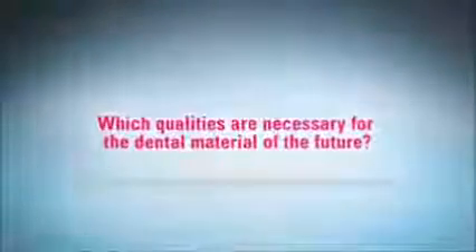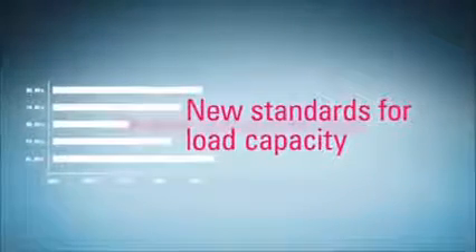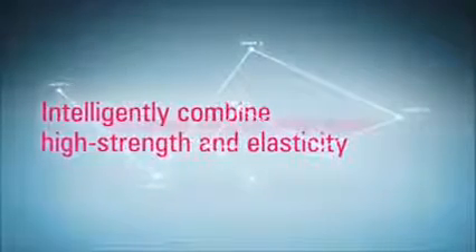Which qualities are necessary for the dental material of the future? It must set new standards for load capacity. It must intelligently combine high strength and elasticity. And it needs to guarantee maximum reliability.